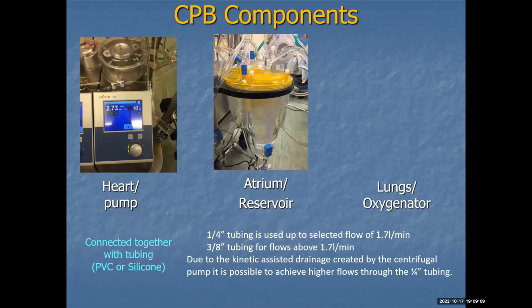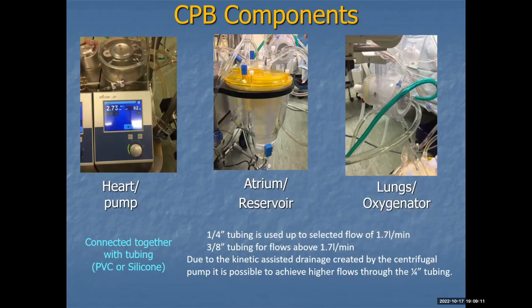A little bit more in depth then. If you were in theatre, sat with me now, this is what I'll be talking to you about. I'll be pointing these out to you. So here we have our heart. This is called a roller pump, and it uses peristaltic motion and pushes fluid around the circuit from the reservoir into the oxygenator. This is what it looks like, and here you'll see the flow. We'll come to talk about patient flow shortly.